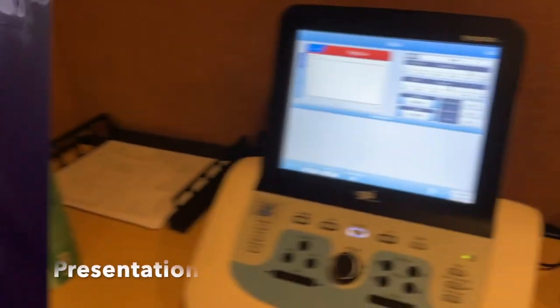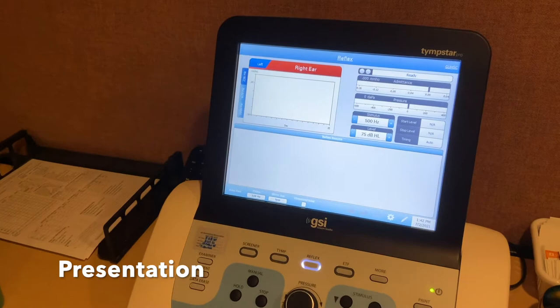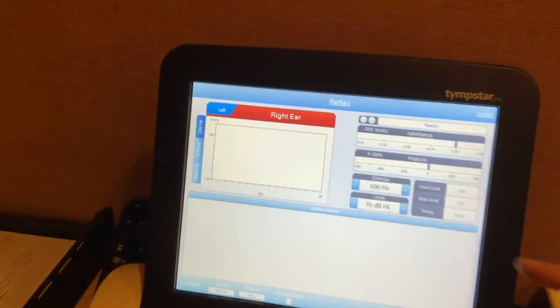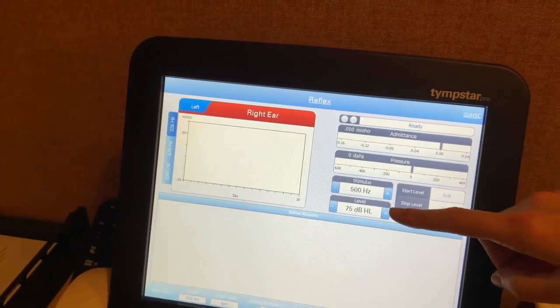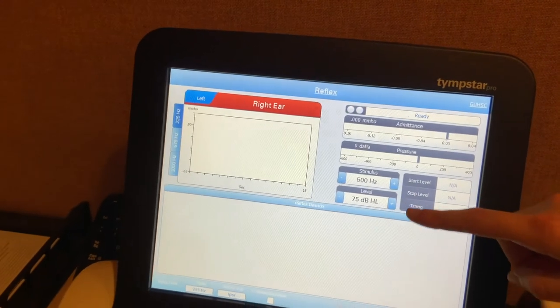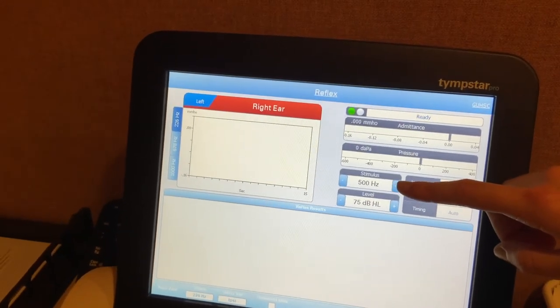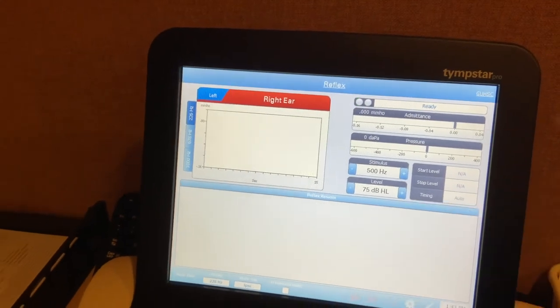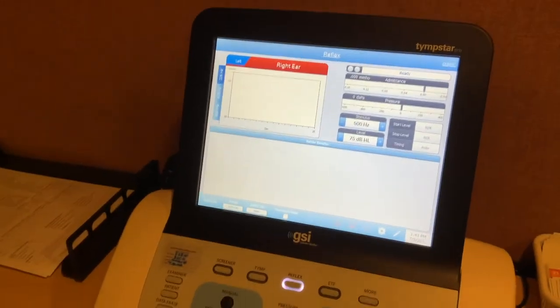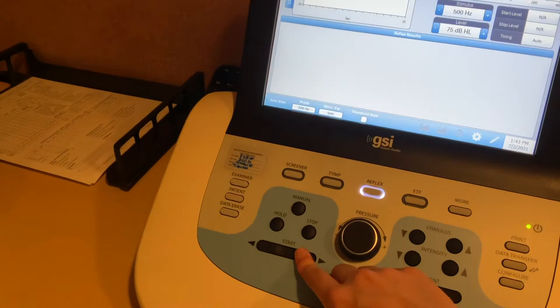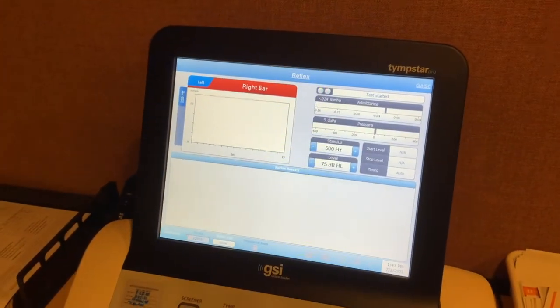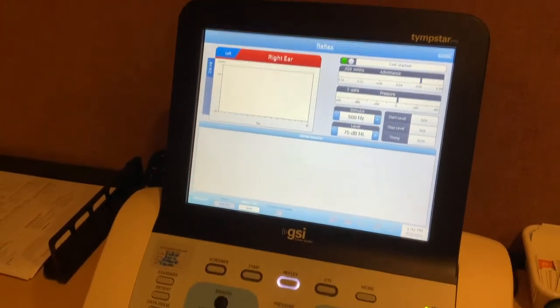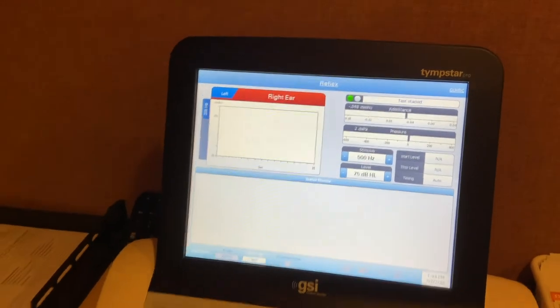Now that your client is all set up, you're going to come over here and make sure that you have the stimulus and level that you want to present. So right now we're going to be presenting at 500 Hertz at 75 dB HL. To start, you're going to want to start the pressure by hitting the start button. And now that it's all pressured, we are going to hit present to present the sound.